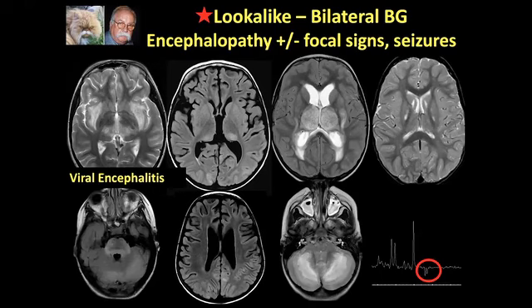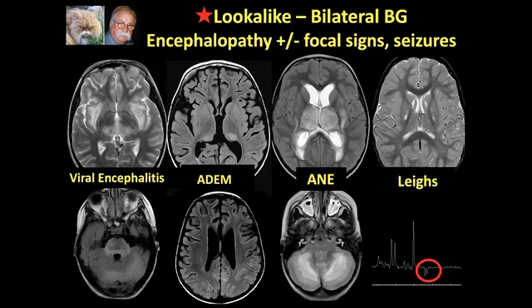Particularly in the setting of encephalopathy, and these patients may or may not have a fever, consider ADEM. If it is hemorrhagic, one should also consider acute necrotizing encephalitis. And then if you have got a lactate peak, consider Leigh's disease. And these can mimic acute infection and be quite difficult to differentiate on CT. But obviously these patients often, because they're not completely fitting the clinical scenario of infection, will come to MRI.